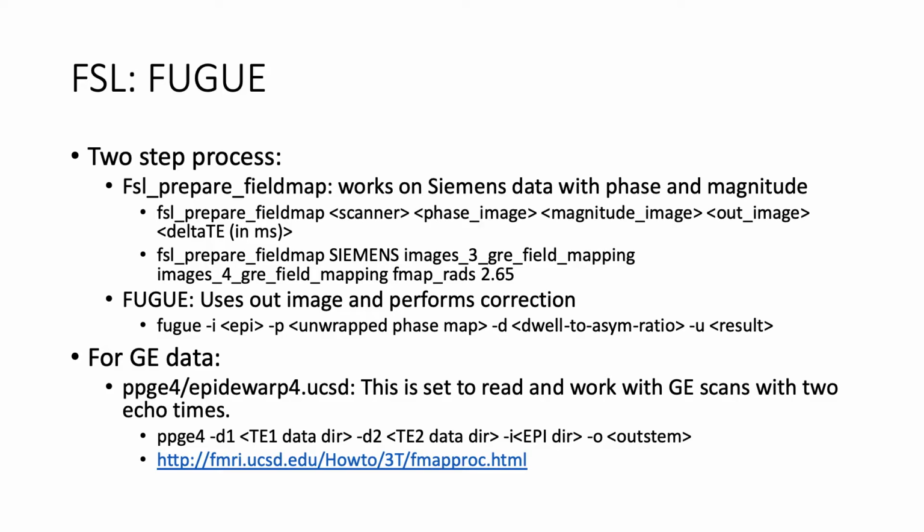And I think it was primarily built and utilized on a Siemens scanner, but I think there have been some adjustments here. So this is, I think, a script. Was this created, the UCSD one? Because this is the link to. That was created here. Yeah, so it was applied on GE scanners.